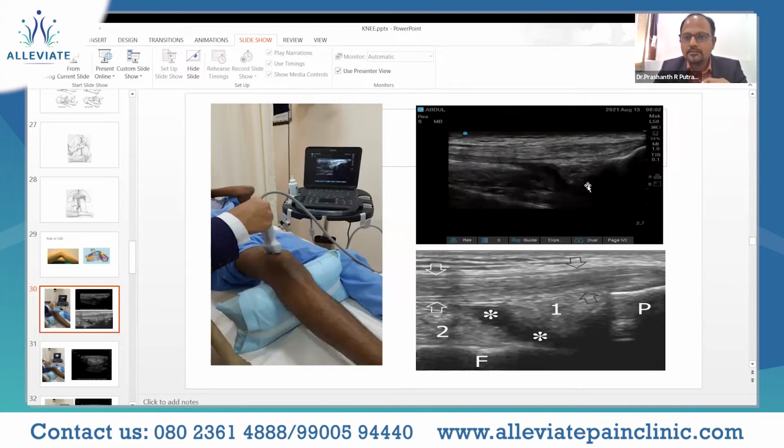And then you have some anechoic shadows over here, and then you have the hyperechoic shadow down. The hyperechoic shadow over here is nothing but the femur. Okay, and then the mixed intensities, that would be the fat. As discussed earlier, there are two pads of fat. One is the prefemoral, which is just anterior to the femur in the suprapatellar area, and then this is the patellar bone.